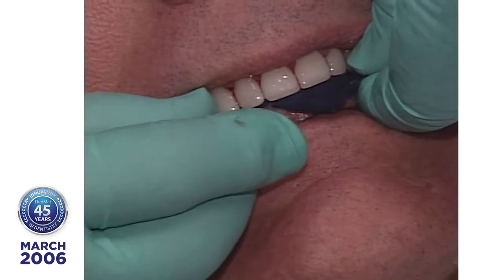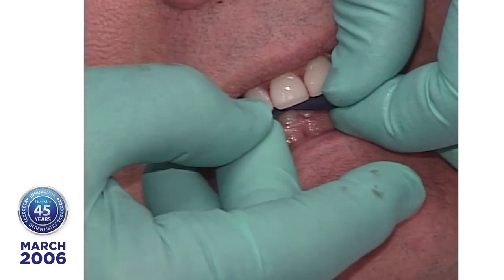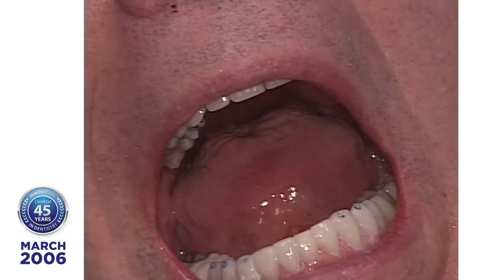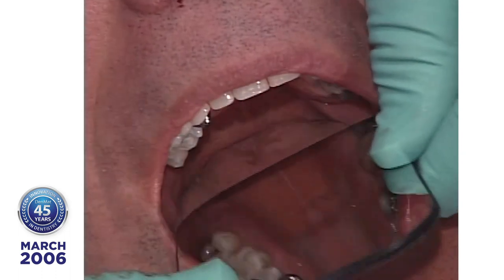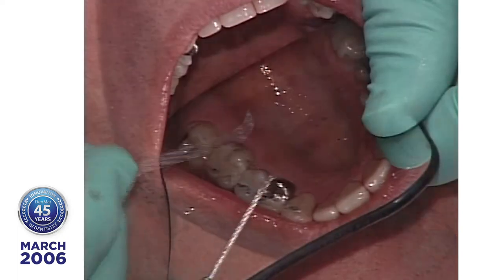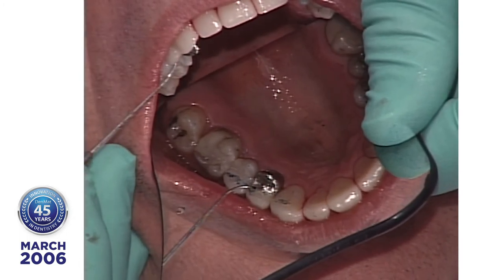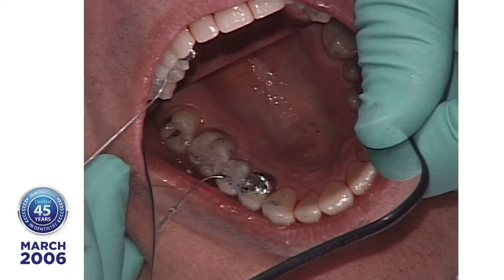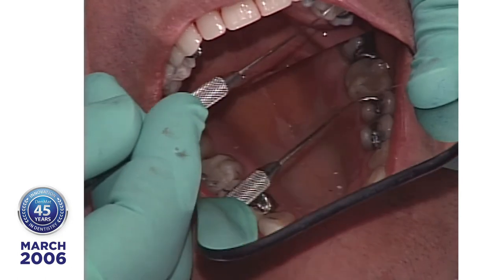Gently close, grind your teeth around, open, gently close, grind your teeth around, open, open real wide, the mirror. Now we're beginning to get multiple points of contact. Let's see what we have on the maxillary first. So I'm getting contact on the natural tooth, contact on the unnatural tooth, the bicuspid, contact on the bicuspid on the natural tooth. Wherever I see the blue, I'll relieve it a little bit. All on the natural teeth.